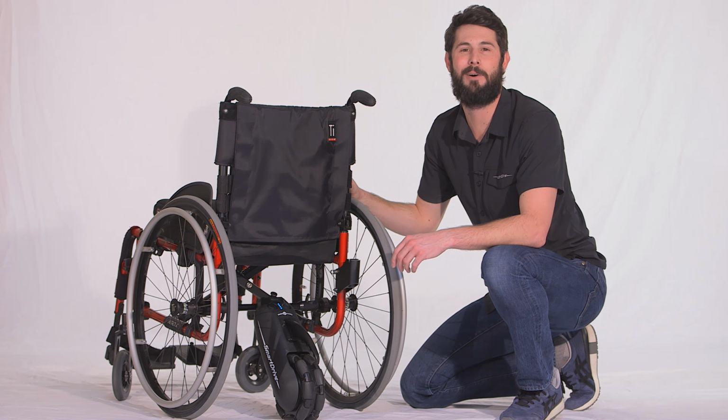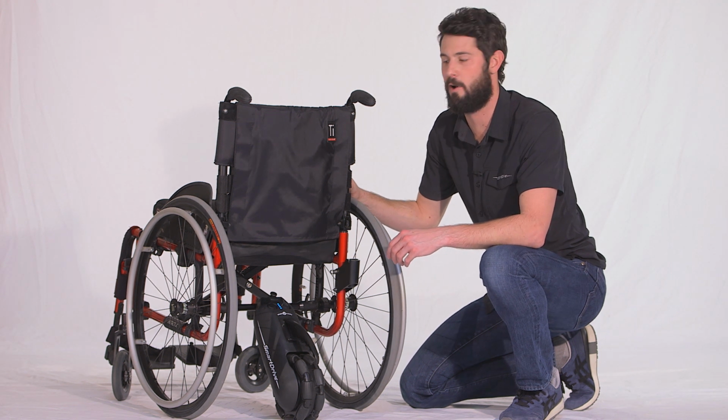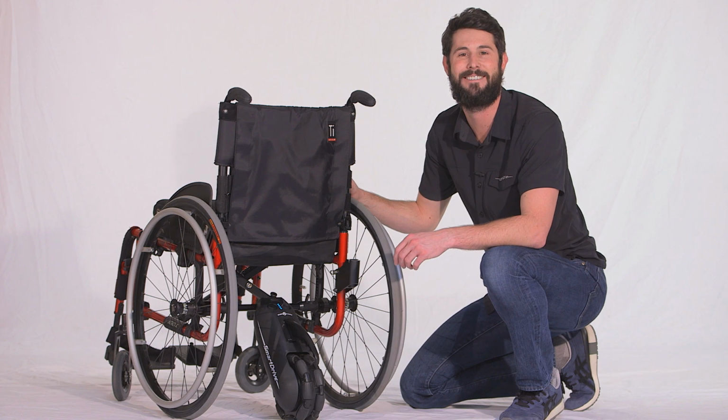Hi, Ben from Max Mobility here, and today I'm going to show you how to set up a SmartDrive to attach it to a folding frame wheelchair.